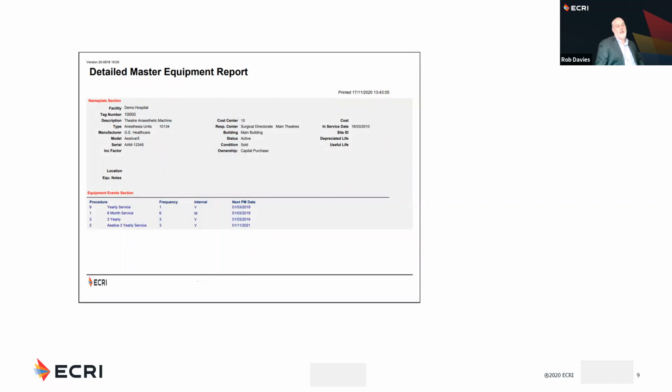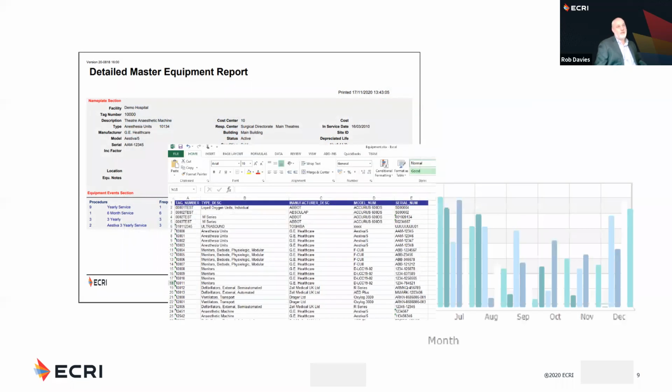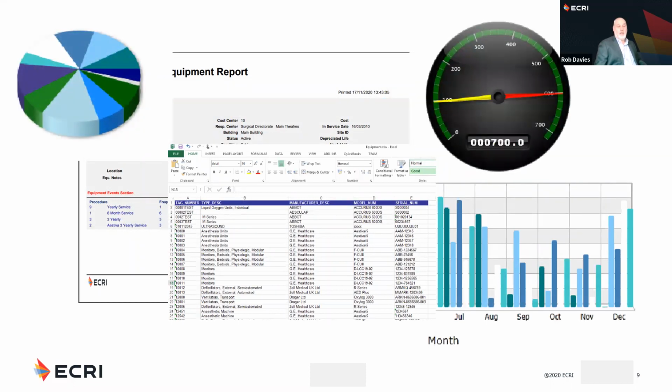We've been putting data into these systems for many years, and we've always taken it out, but the way we're taking it out is also changing. There was obviously the traditional formatted printed report, and then people started putting it into spreadsheets, producing graphs, charts, and nowadays it's common practice to see complex digital dashboards with gauges showing all sorts of KPIs and data relating to maintenance and equipment and all sorts of things. So this is how things are changing nowadays.